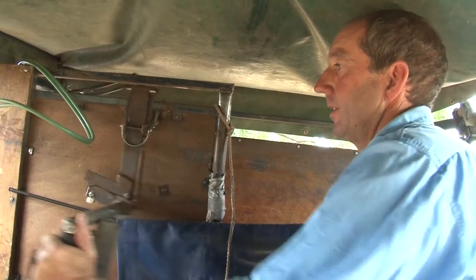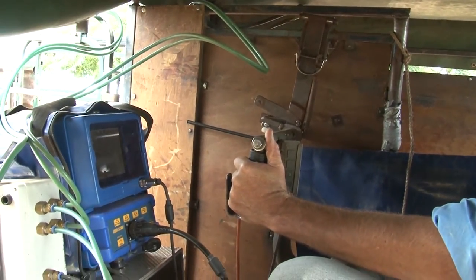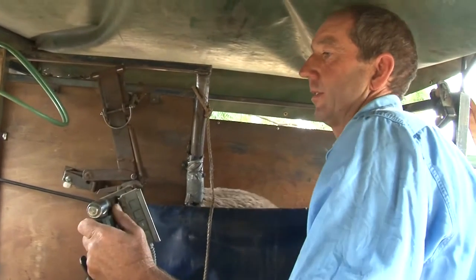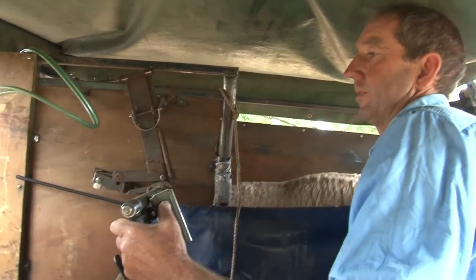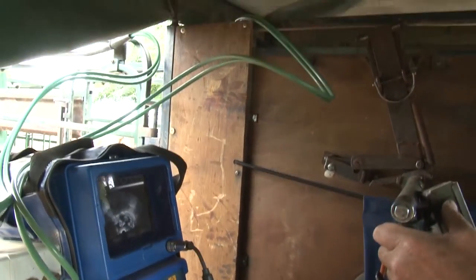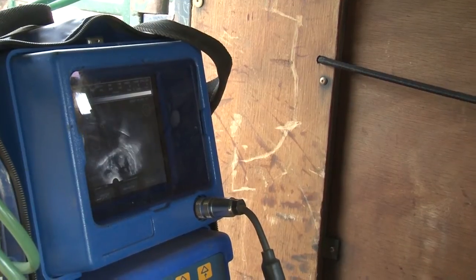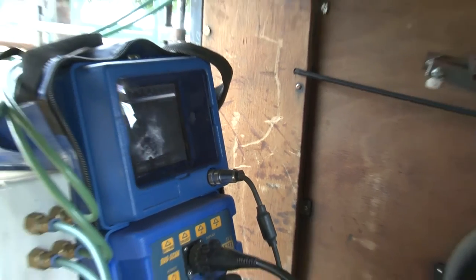We generally have our scanning crates set to the right size so that the ewes are not too boisterous. Once again, make sure we've got good contact. Nice scanning these. See the cotyledons there — you can see she's pregnant. Nice head in the middle there, body slightly to the right, out the other end of the uterus. We're fanning from one end of the uterus to the other. Nice single.